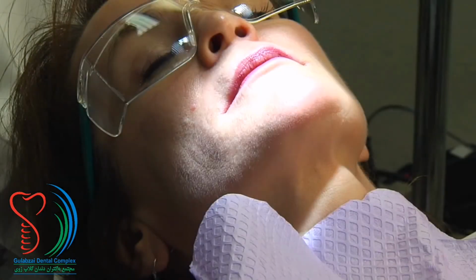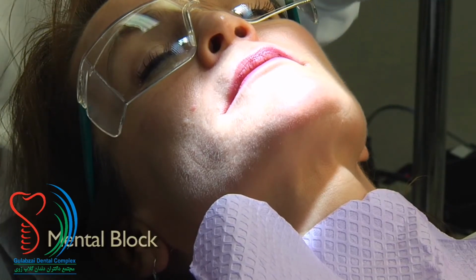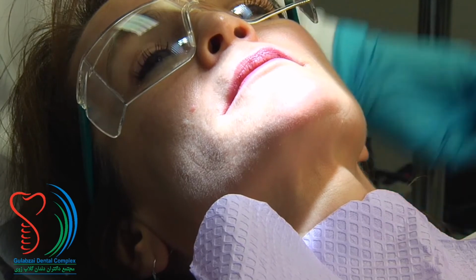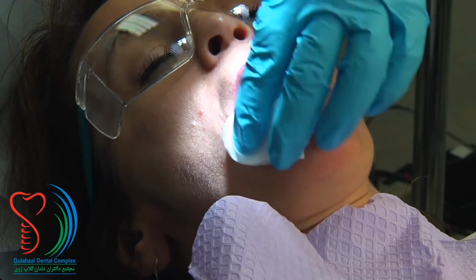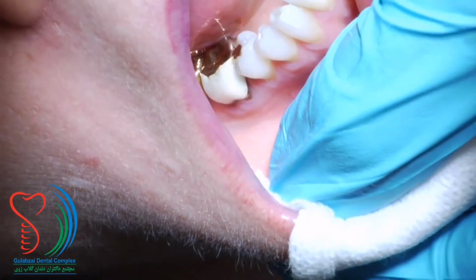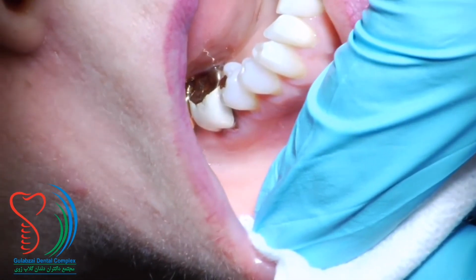For the mental injection, generally the operator is sitting above and behind the patient in about the 11 o'clock position, grasping the lip with the thumb and fingers and retracting so they can visualize the vestibular area and the premolar region. Pull out the lip with the thumb and first finger, pinching it slightly for distraction.